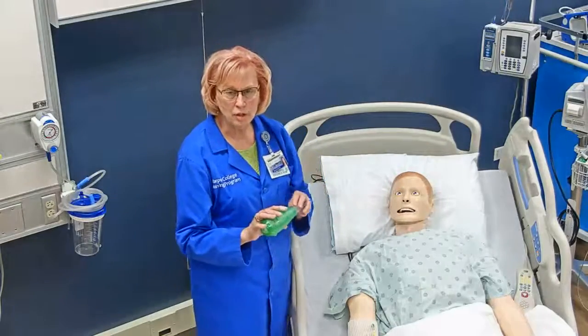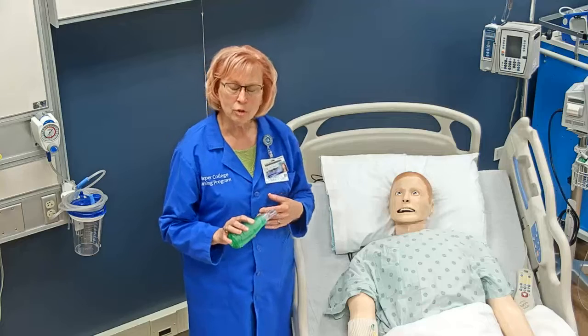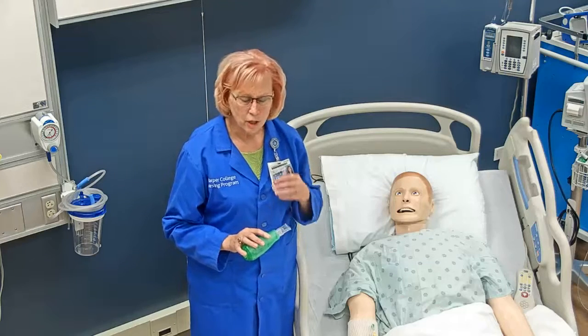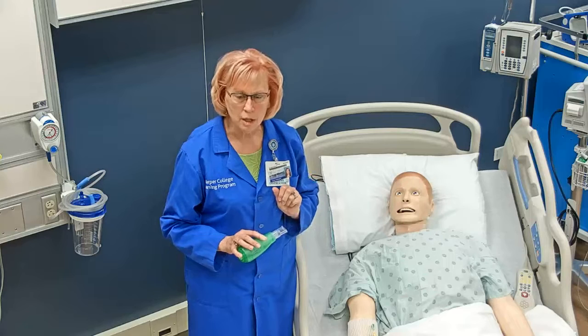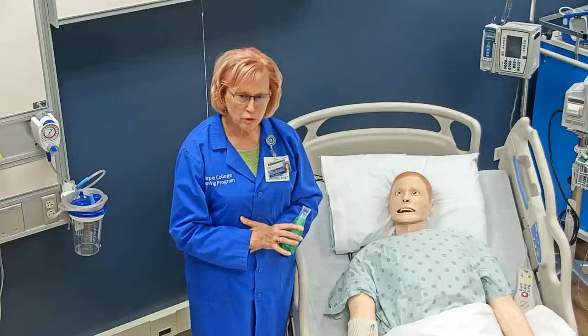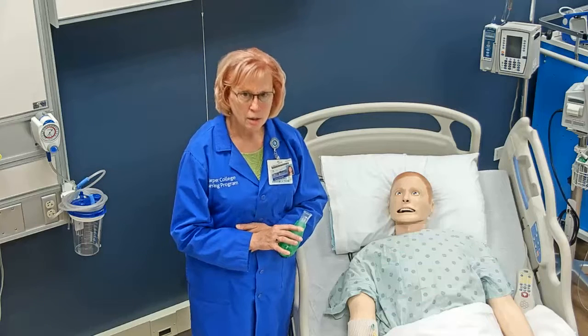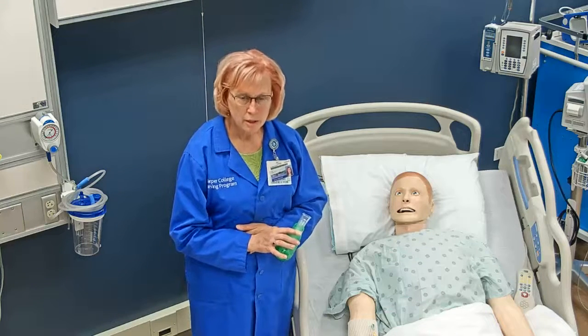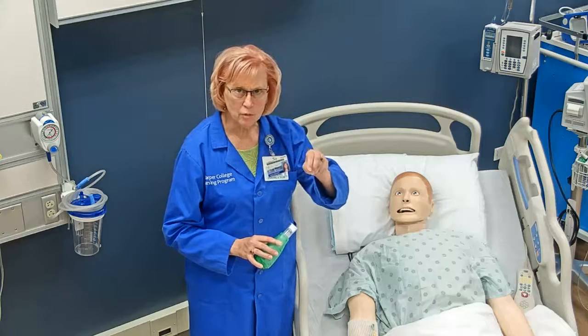After the patient has done this a few times, they can try to cough using what's called a huff cough. A huff cough is like blowing out the candles on a birthday cake. The patient can even hold their stomach if they want to — they take a breath in and blow out. This helps loosen those secretions so that the patient can cough them out.